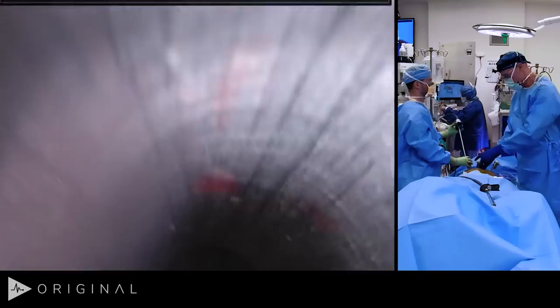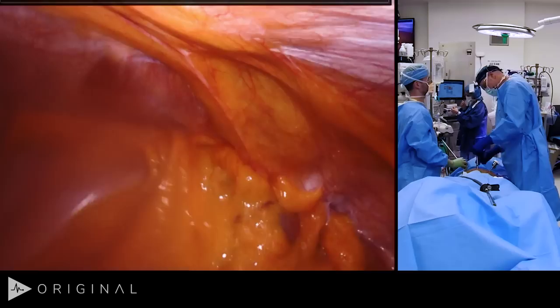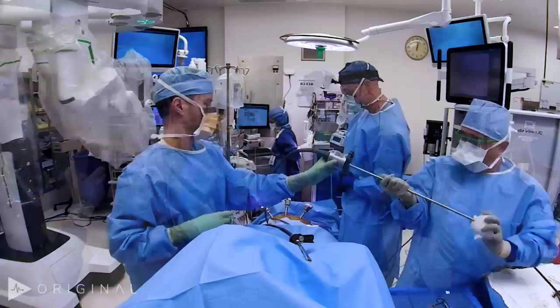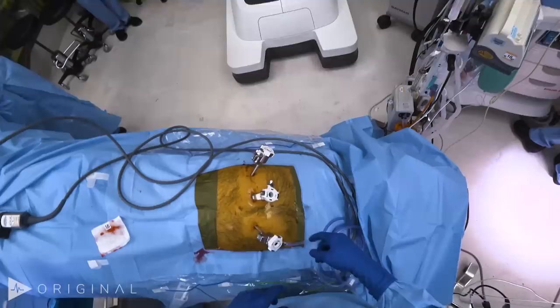We swap out the Covidien port for the robotic 12mm trocar and adjust the remote center. Then we bring in the robot, rotating the arms so they point anteriorly. We center on the center port and check the dynamic range, wanting it to be about the middle of the range. We get the 8mm port downsizer and put in our camera port first, then clutch the camera and come in. You can see this is his hernia.